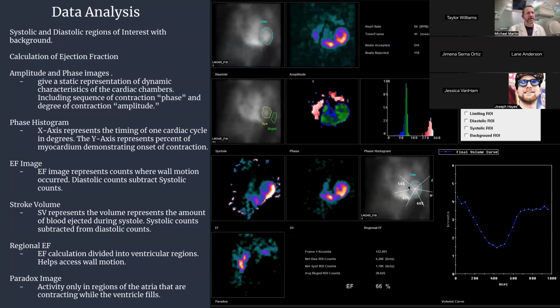If I pulled this up and I had like 69 over here and 56 over here, I'd be going, well, what's going on with that lateral wall? I have to start questioning at that point, is there some heart failure going on, or is there a blood flow issue and we're not getting good contraction because it's got some sort of narrowing or blockage going on? Like what is the problem here with the beat? So it just separates it, looks more individually at the sections of the heart.